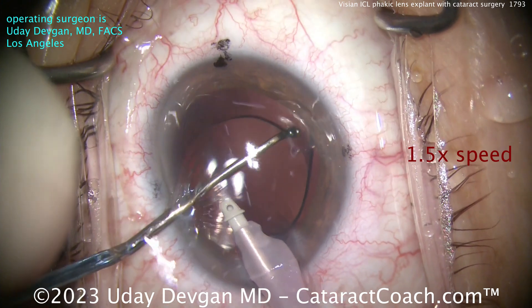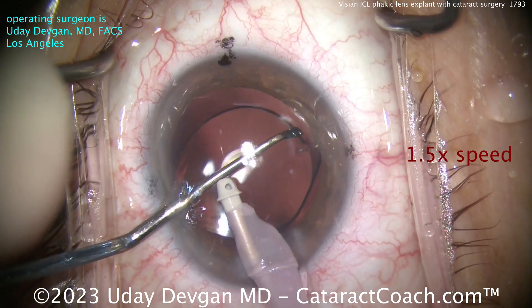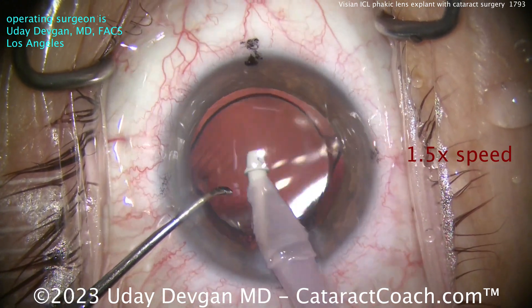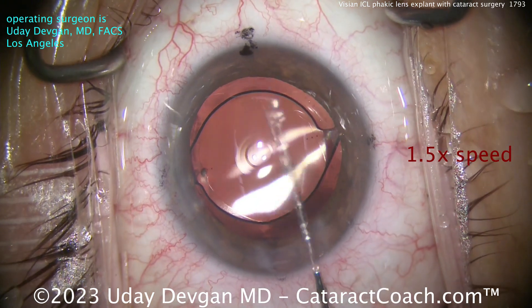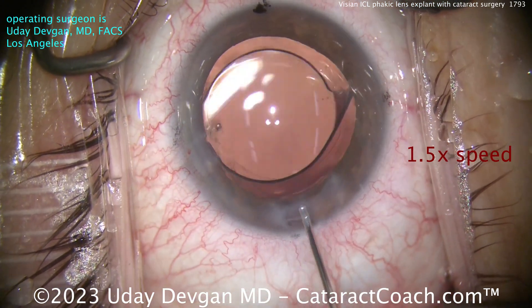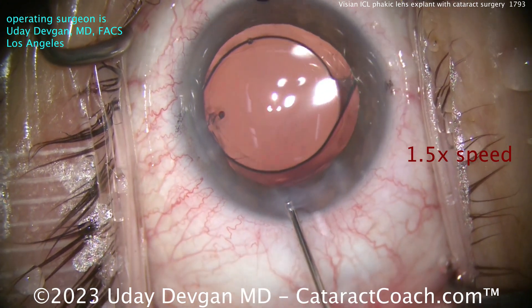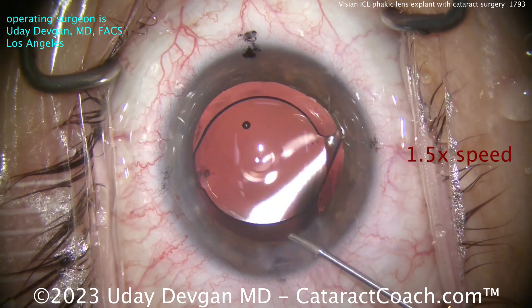Just dialing that lens around. You can see there are marks on the cornea as well as marks on the lens, and if we line those two up, you can see that central focusing element of the EDOF lens — get that right there in the center, patient will do well. Now look how wide the incision is — wider than typical. Let's get that sealed up with a little bit of hydration, and we'll check at the end to make sure it looks really good.